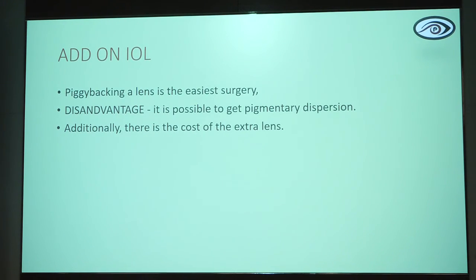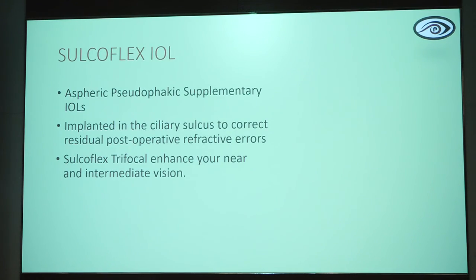So piggyback lenses are, of course, the easiest surgery. The only disadvantage, I have come across this complication, is in patients with pigmented dispersion. Of course, these piggyback lenses are much more expensive than the regular lenses also. You need to think about that. I have been using this Sulcoflex lens from a company in London, no financial interest. A lot of patients post cataract surgery wanted to implant a multifocal lens. I tried this Sulcoflex multifocal lens, and it has given me tremendous results.